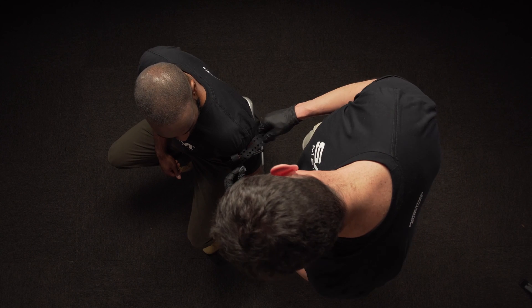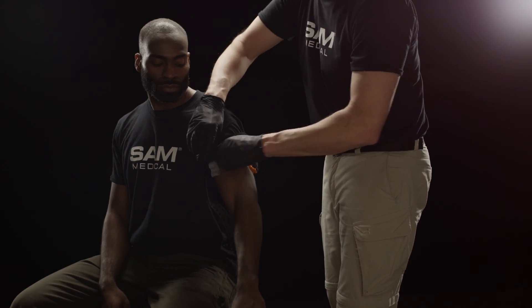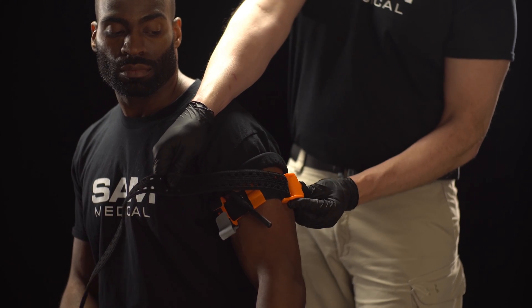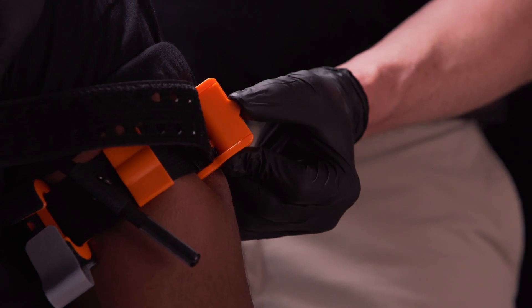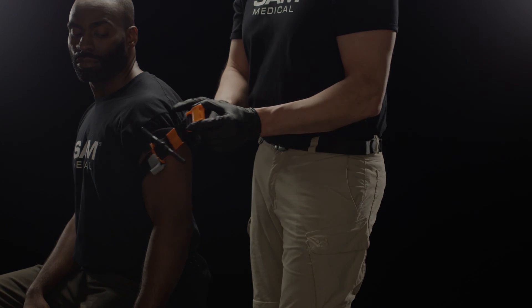To remove SAM XT, undo the time band, release the windlass from the hook, and untwist it. Lift the tab on the front of the TruForce buckle to allow the prongs to retract. Dispose of the device per facility policy.